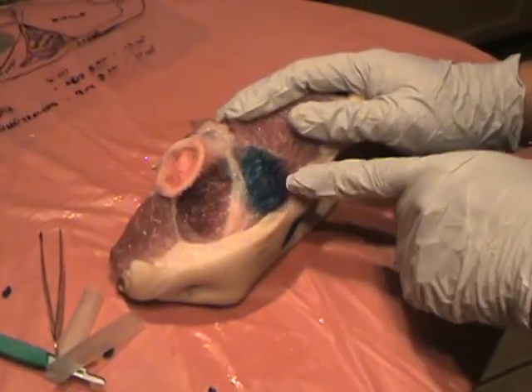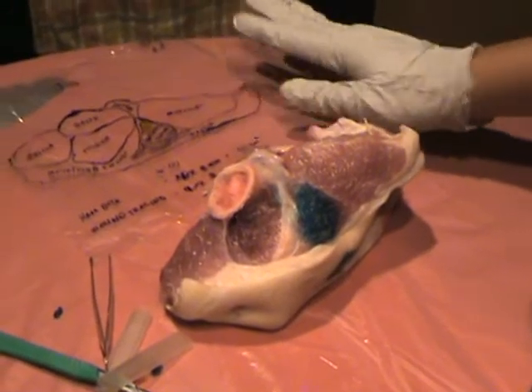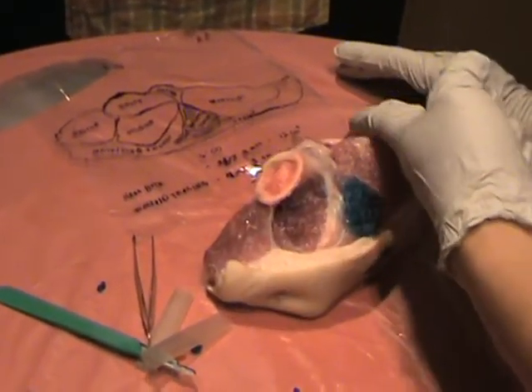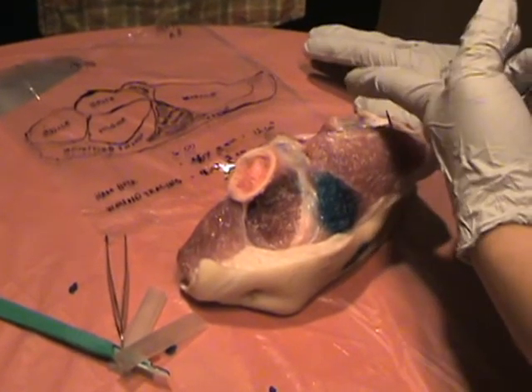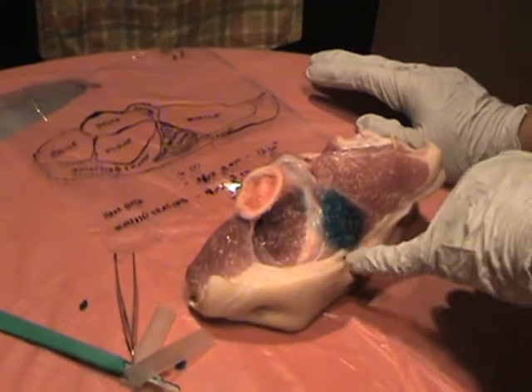Okay, so I guess that's the end of the exercise. I got the cross hatch in here, the shaving, the sharp debridement over the muscle right here, and the wound trace, which resulted in a surface area of the correct tissue of 12 centimeters square, comparable to the measurement that we get from the ham hock.